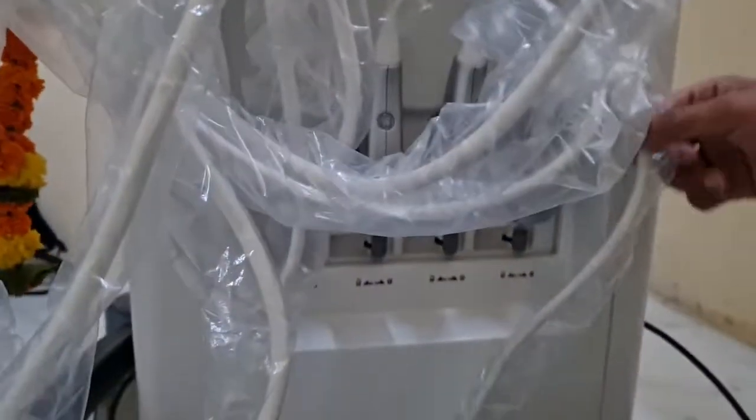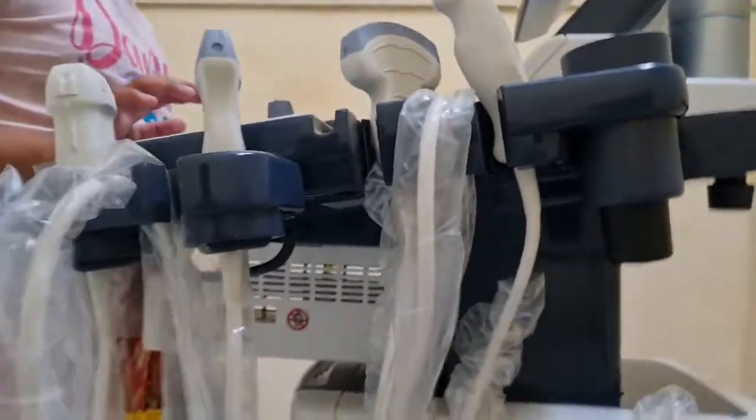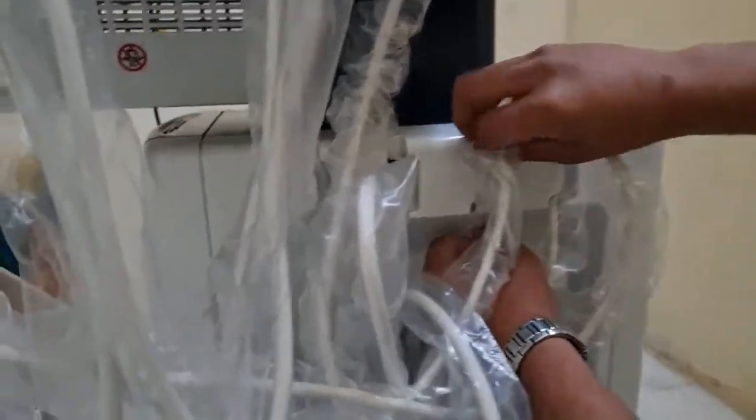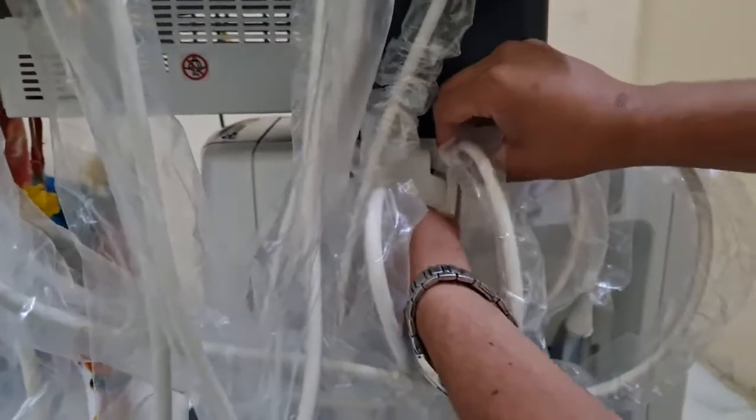Okay, these wires, you can slot these wires in this holder, like this, to prevent connector wire damage. All the probes you can connect here and slot in this probe holder.